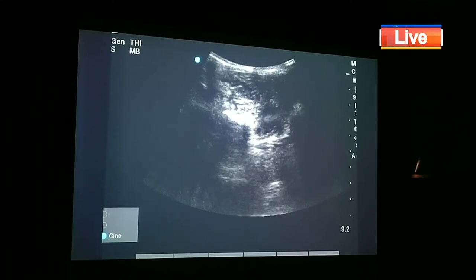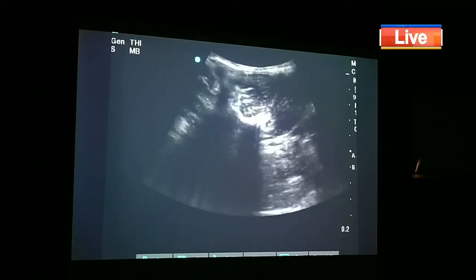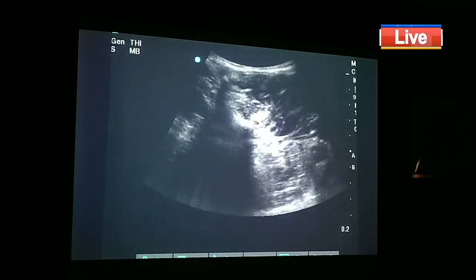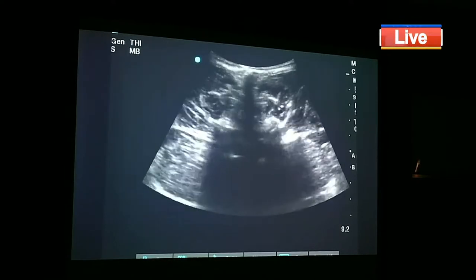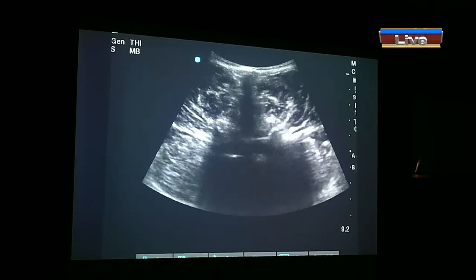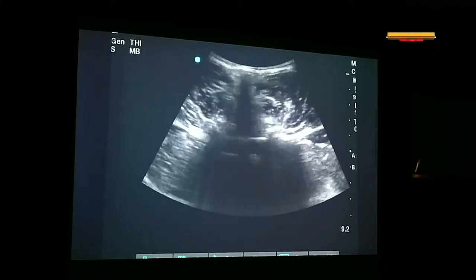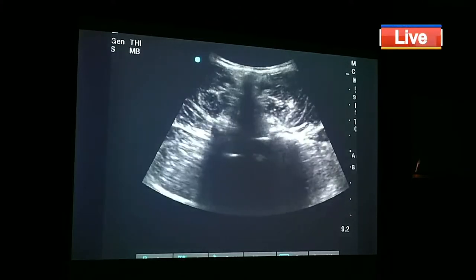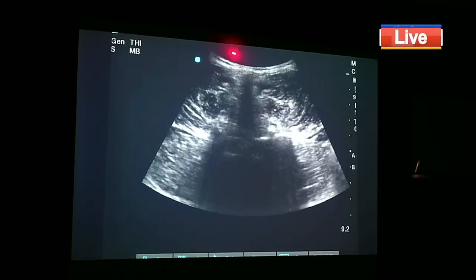So you have to understand this very nicely. Let's go up further. I have shown you one level, now let me go further up and corroborate all this. Now you see these two structures again coming. You can clearly see two structures here. Let me try and make them better. How am I making them better? Just by slight panning, zooming, tilting.